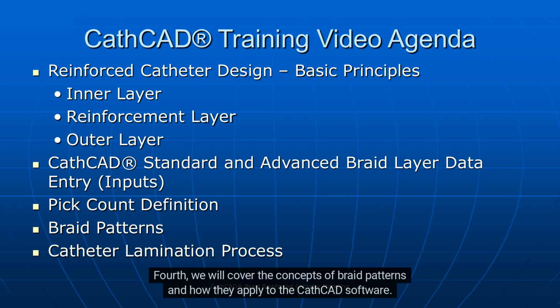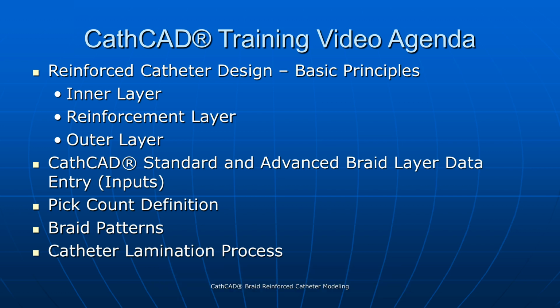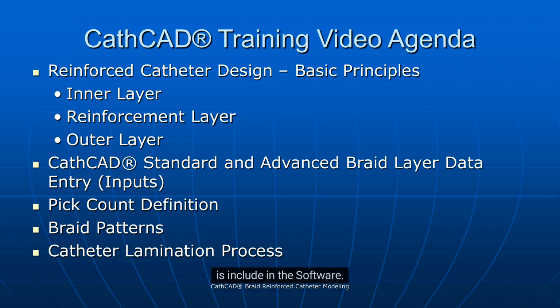Fourth, we will cover the concepts of braid patterns and how they apply to the CathCAD software. This section will also cover the topic of surface area coverage, which is one of the outputs from the CathCAD software. Finally, we will review the catheter lamination process and illustrate the fuse-down modeling utility that is included in the software.